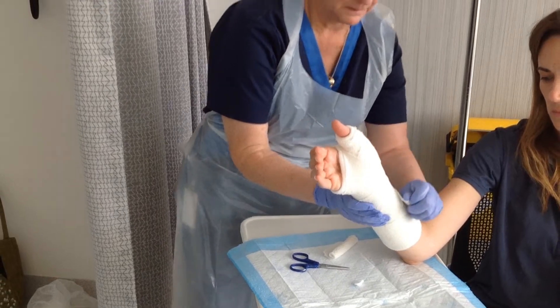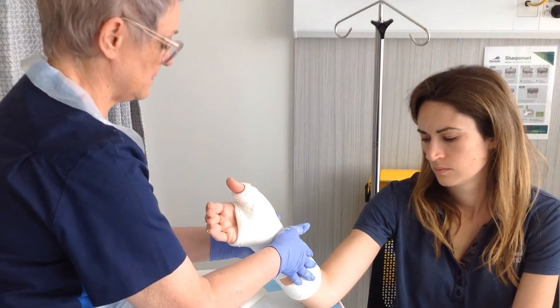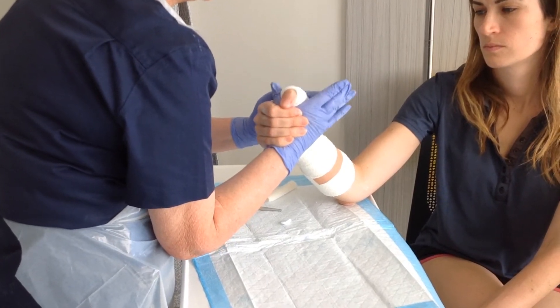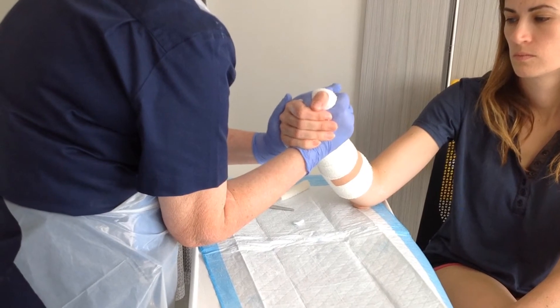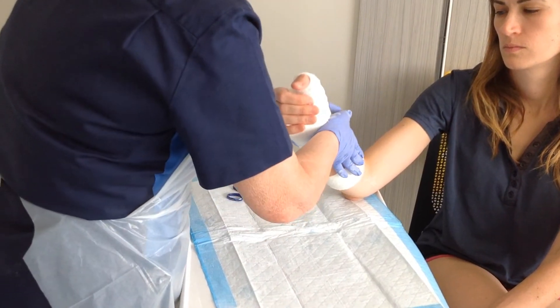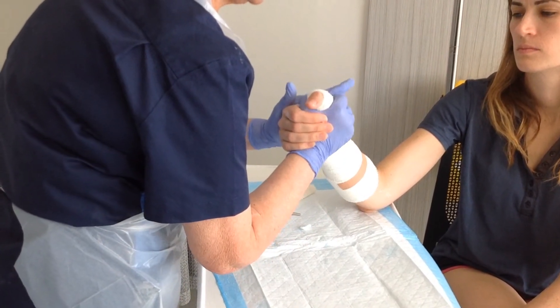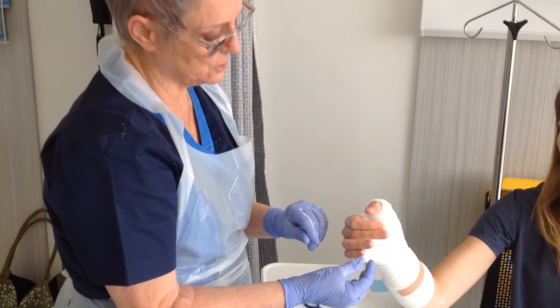Cut off the excess and take it down. The next thing we need to do is our moulding. We get the patient to do the biker's grip like so, and we're just moulding in between the web space and around the thumb so it actually takes grip around the thumb — just hold that for a few minutes. Then we do some moulding at the wrist to make sure it's taking a grip, using flat moulding because the arm isn't cylindrical — we need to make it the shape of the arm. Keep moulding as you go up and down. So that is a thumb spica back slab.